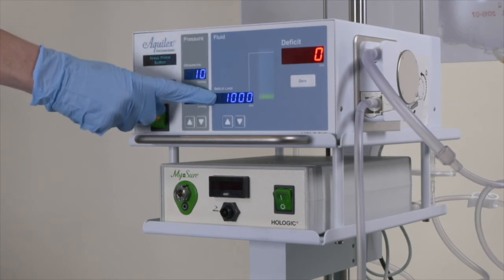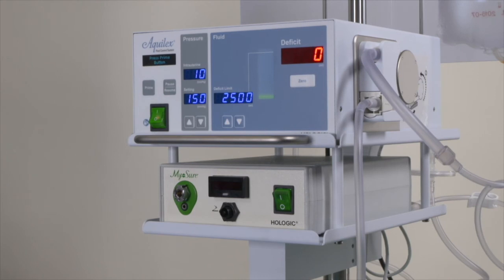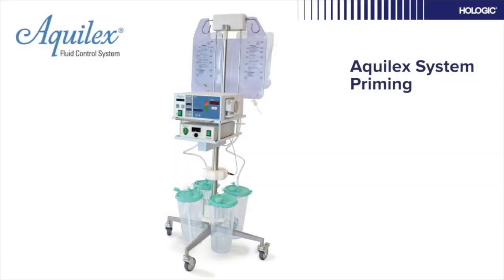For a healthy patient, set saline fluid deficit limit on the Aquilex to 2,500 millilitres. Always refer to local guidelines. Now you are ready to prime the scope.